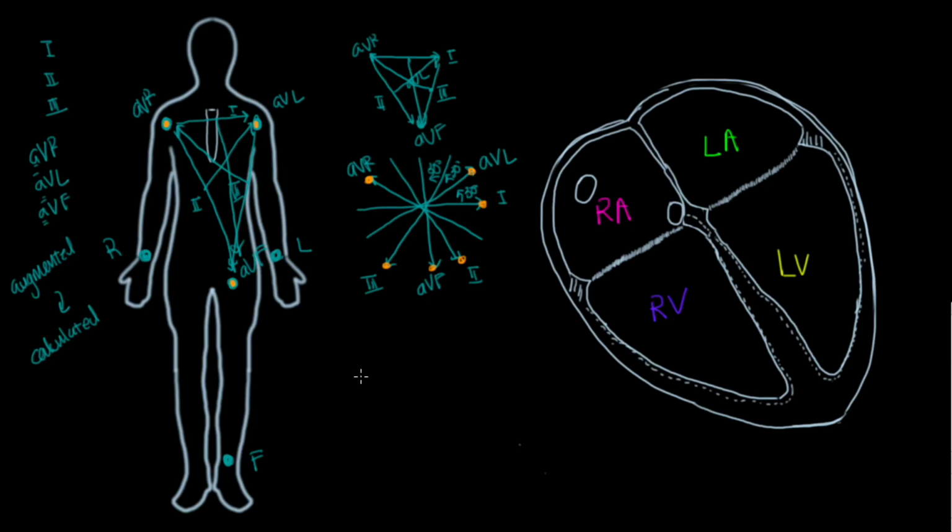And so let's try using this. Imagine you have a positive charge here, and it's moving straight across that way.